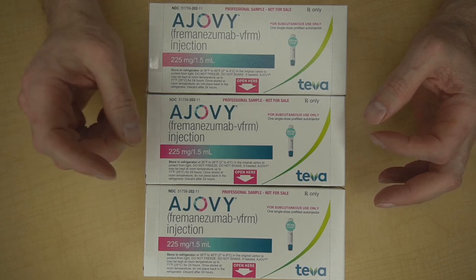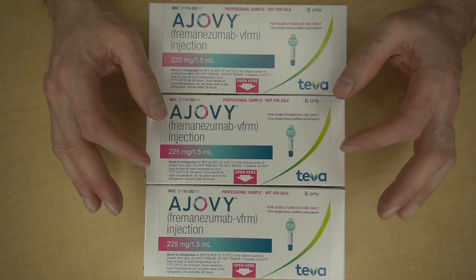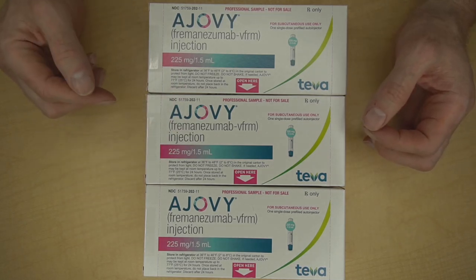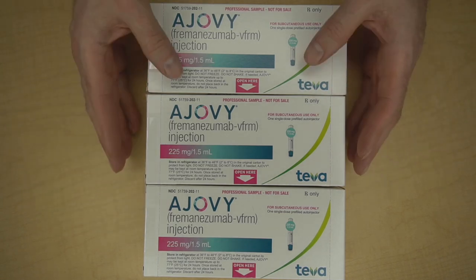Step number one is to get ready. And whether you've chosen to use Ajovi quarterly or monthly, the steps for an individual injection are similar. To do the quarterly treatment, just do three separate injections, one after another.